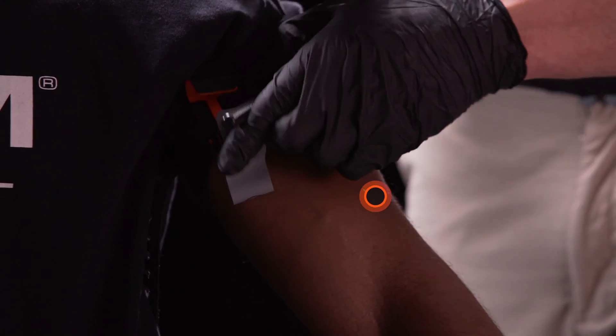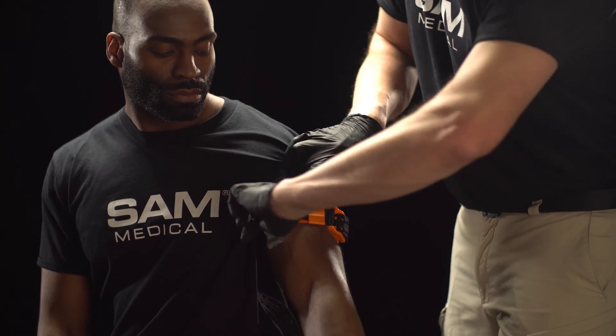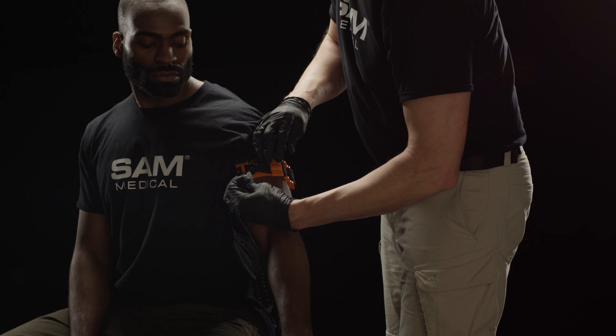Twist the metal windlass rod until the bleeding stops. Secure the rod inside the windlass C-hook and confirm that bleeding has stopped. If bleeding persists, tighten SAM XT with additional twists of the windlass.